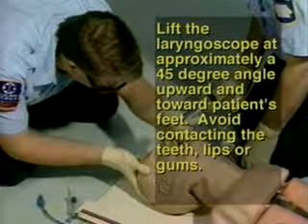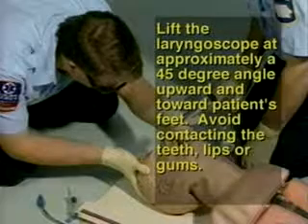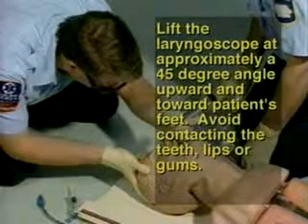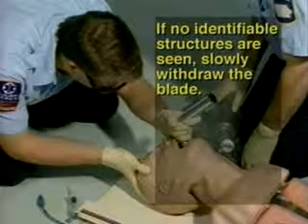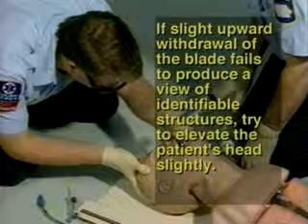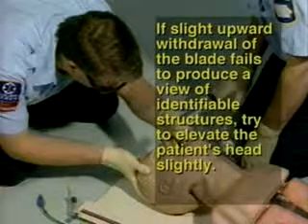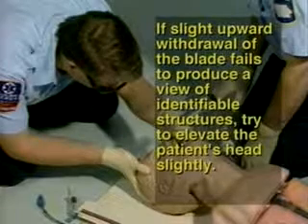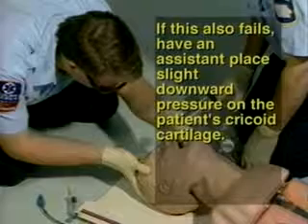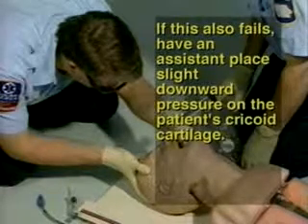Step 11: Lift the laryngoscope at approximately a 45-degree angle upward and toward the patient's feet. Avoid contacting the teeth, lips, or gums with the laryngoscope. Step 12: If no identifiable structures are seen, slowly withdraw the blade. If slight withdrawal fails to produce a view, try to elevate the patient's head slightly if no spine injury is suspected. If this also fails, have an assistant place slight downward pressure on the patient's cricoid cartilage — the Sellick maneuver.